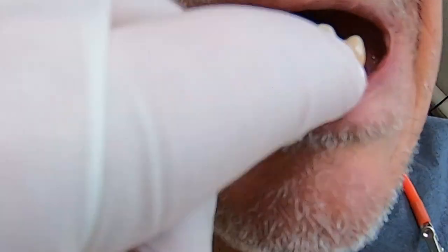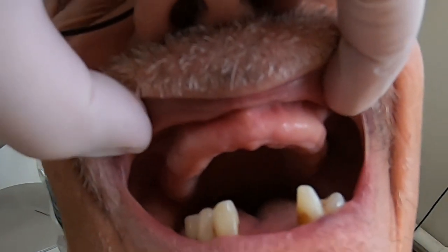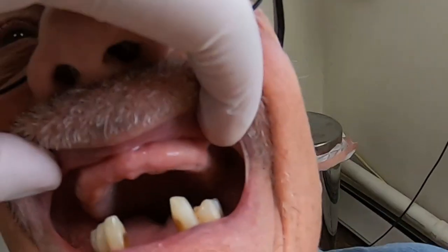And then on the upper, he's missing all his teeth, but he's got a really nice jaw. The ridge — his residual ridge up on top has very good height and thickness.